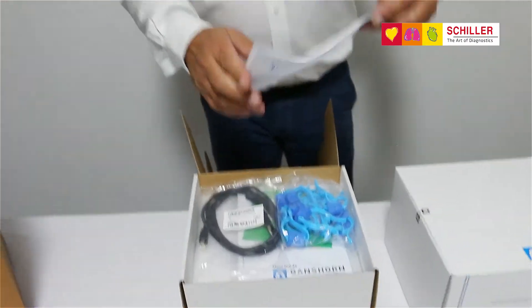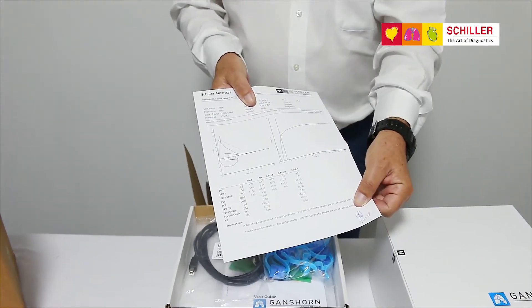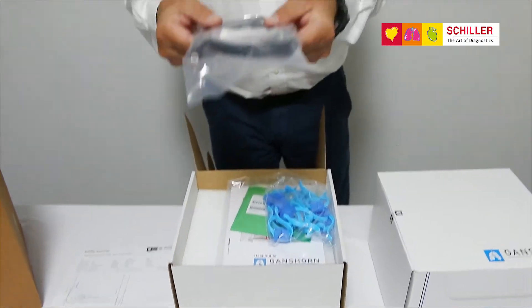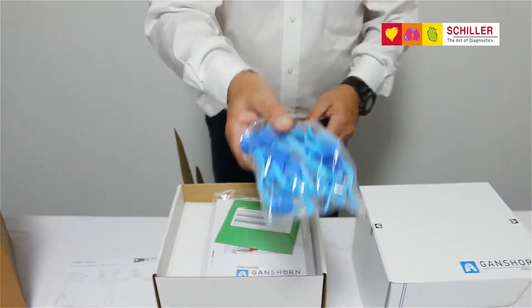Inside you will have your certificate of use, USB connector, and 10 nose clips.